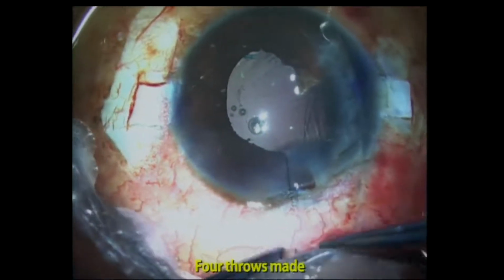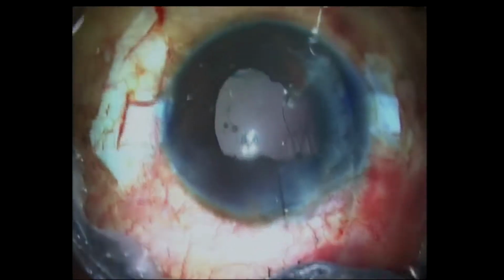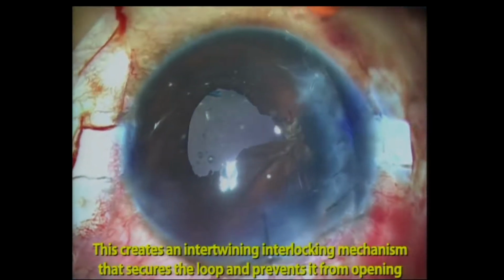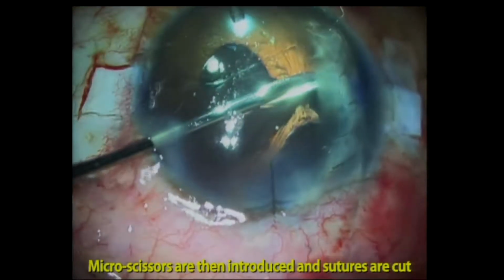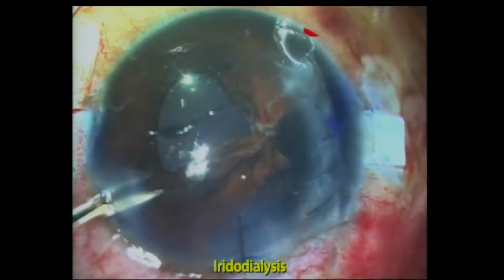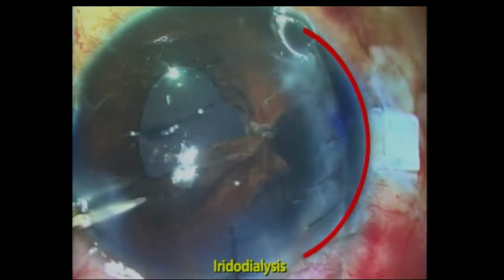Now, using a pupilloplasty, that is a single pass four-throw, you're doing a root repair. Once this is done, you pull the two ends apart, and you have these two joined. Now you still have to analyze again. Now watch what I have here. I have close to 180 degrees of iridodialysis. I cannot leave this patient like this. The iris is completely coming into the pupillary zone. So this is not normal.